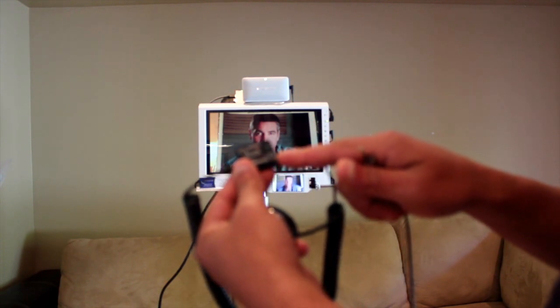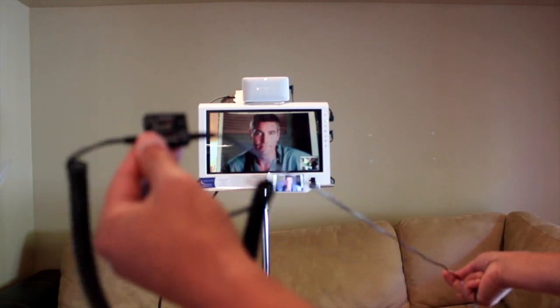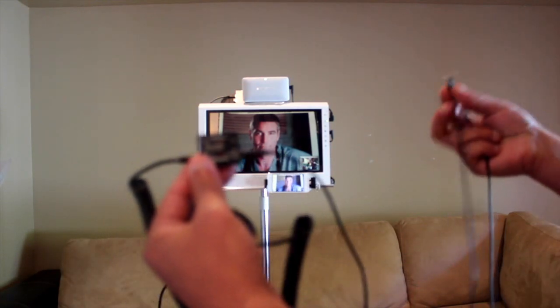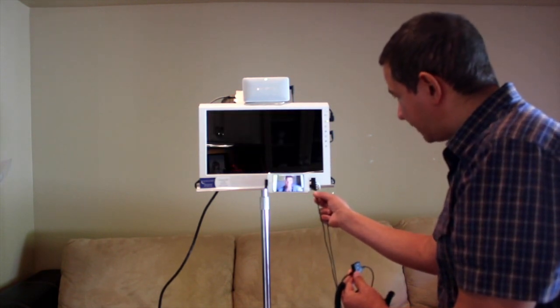Opposite the stethoscope is a rectangular box. The wire for that box will go to the Mighty itself and will plug into this port right here on the Mighty, into the handheld.